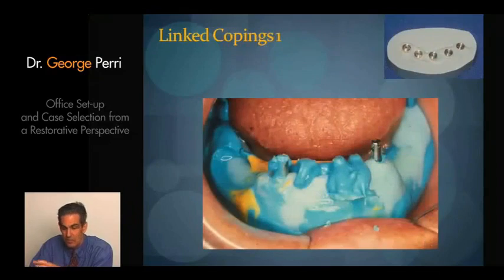I fill it with impression material, seat it. One other little technique thing is make sure that that coping is dry. Blow air on it so that when you put your impression material on it, you have a good tight interface between the impression material and the coping.